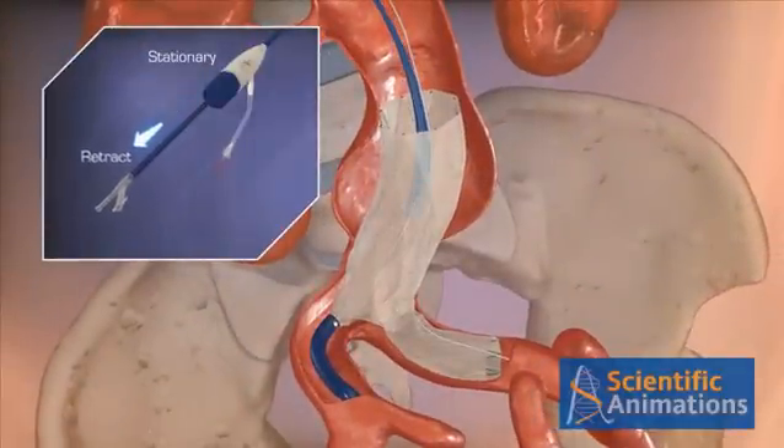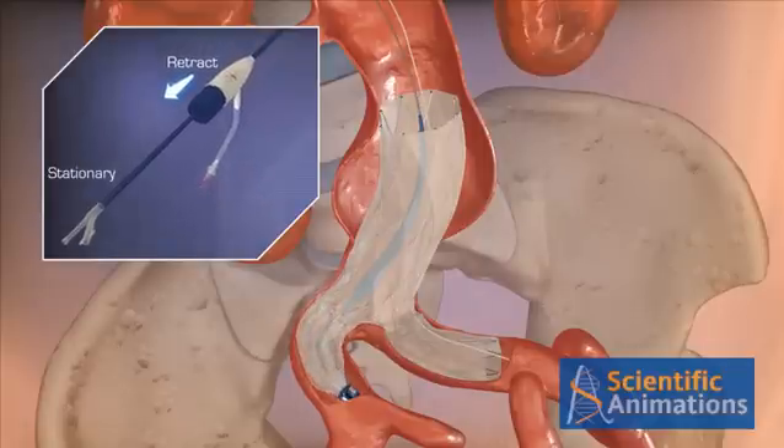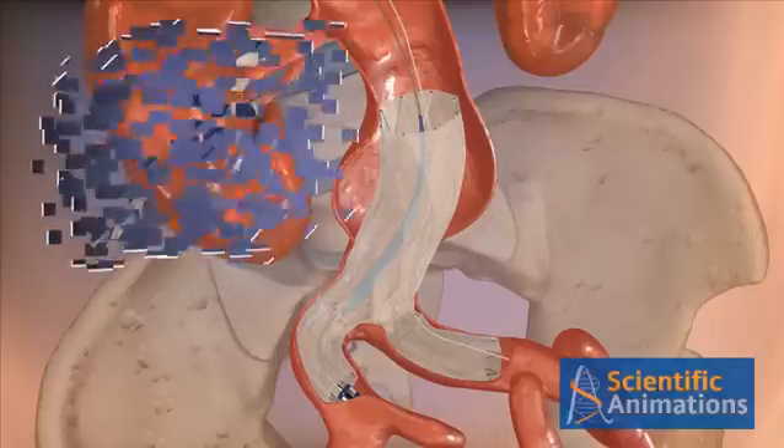To deploy the ipsilateral limb, pin the introducer sheath and retract the inner core until the radiopaque tip is just above the bifurcation. Then, pin the inner core and pull the retraction hub to complete the deployment.